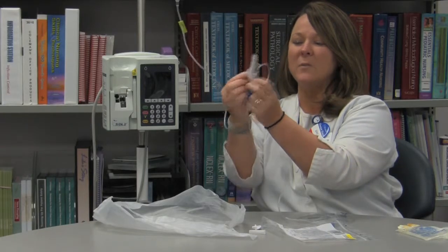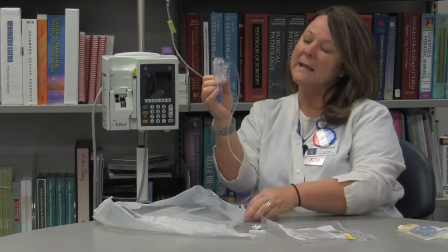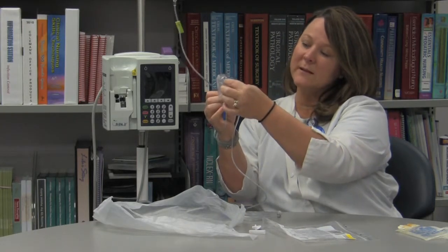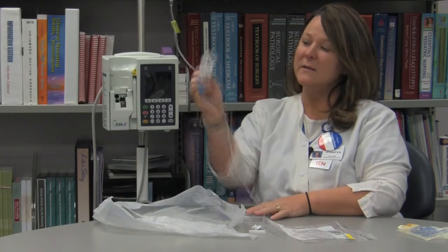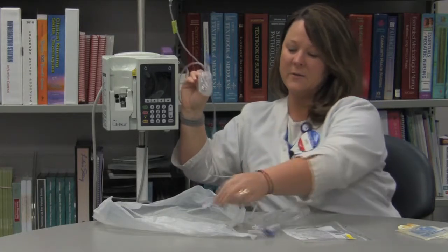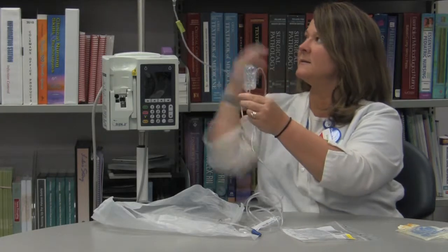We're going to have to open our clamp. So the clamp on the back, I'm going to completely open. And what we're going to do is let this odd-shaped chamber completely fill with fluid. When one drop hits that dome, then we're going to flip it and let it finish priming like any other tubing. All right, so we're going to invert the cassette.